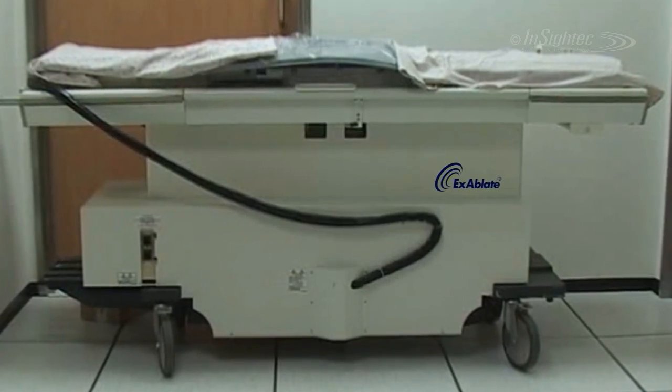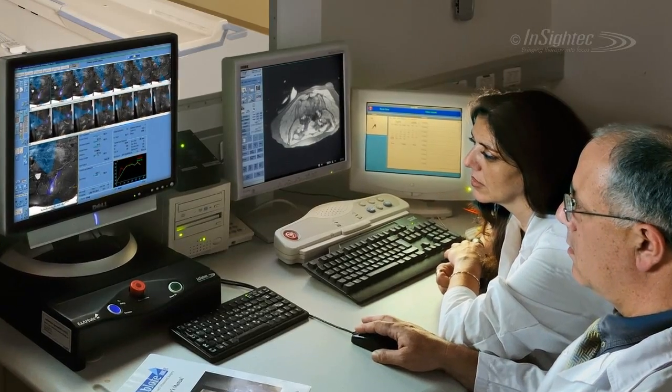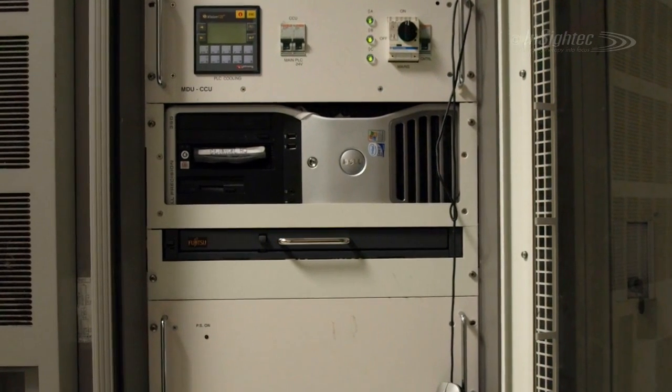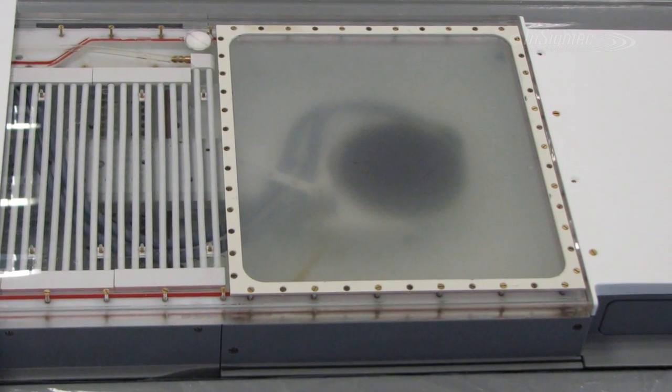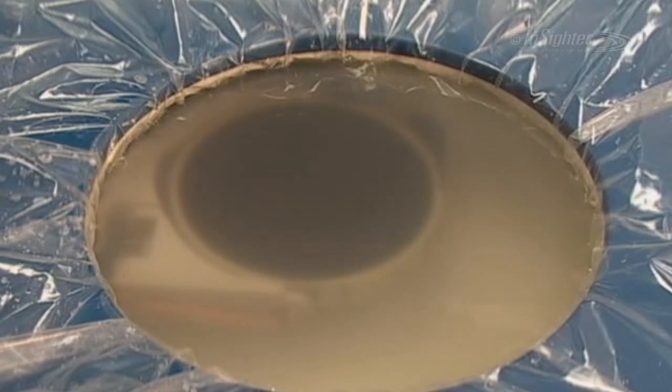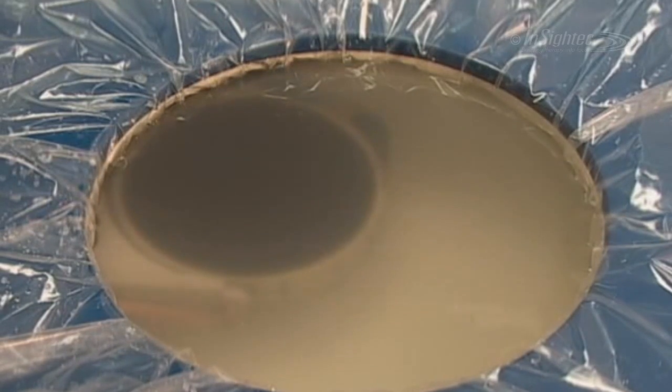Exablate consists of a patient table, a workstation, an equipment cabinet containing the electronics, and a water cooling system. The focused ultrasound source is an electronic phased array transducer immersed in a sealed water bath. The focal depth in the body is controlled electronically to adjust the bone surface sonication size.